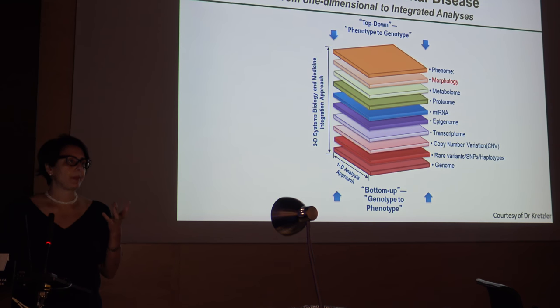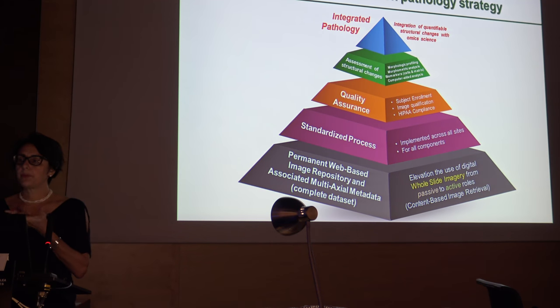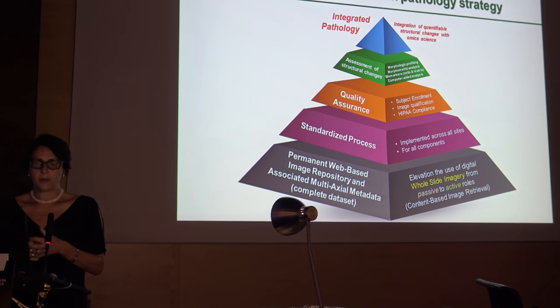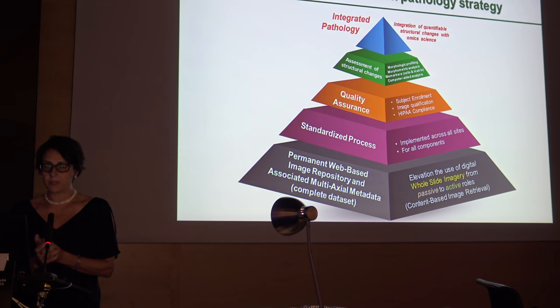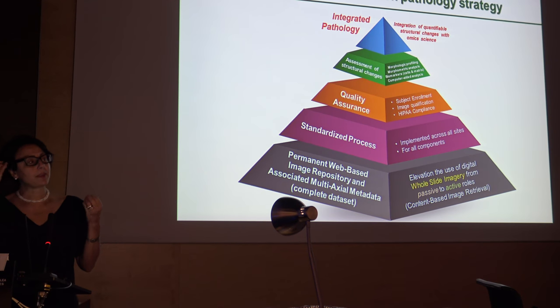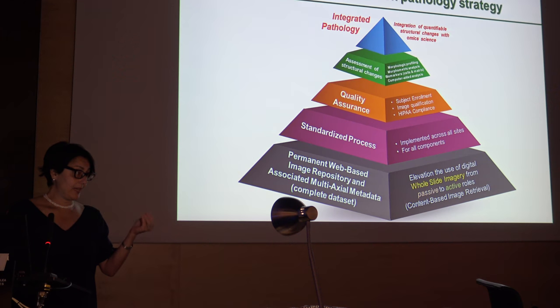How does digital pathology help us in doing so? I think it's becoming very important. If we want to do integrated pathology, we need to build it on a very solid base. And the permanent web-based image repository is really a way to do that, because you can also associate multi-axial metadata to it. But also, the use of digital pathology allows you to elevate the digital images from a passive role to a more active role.